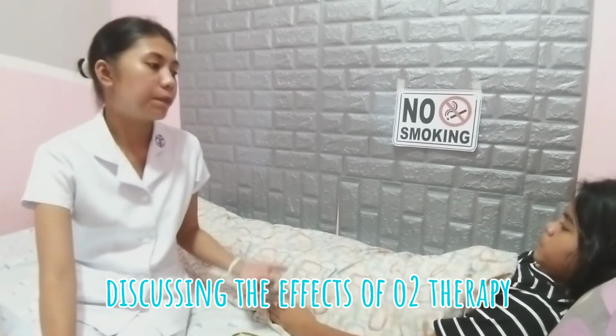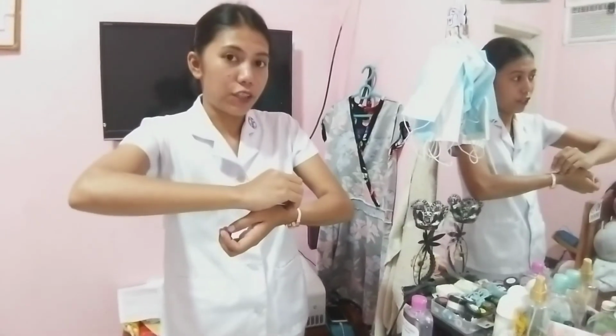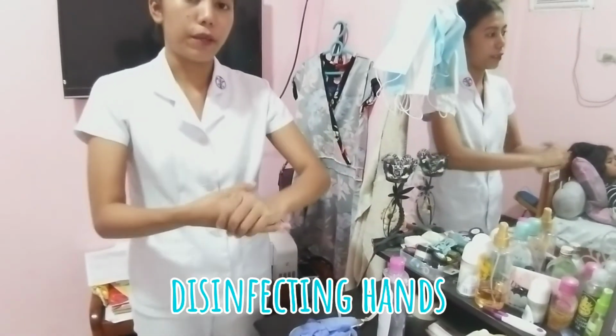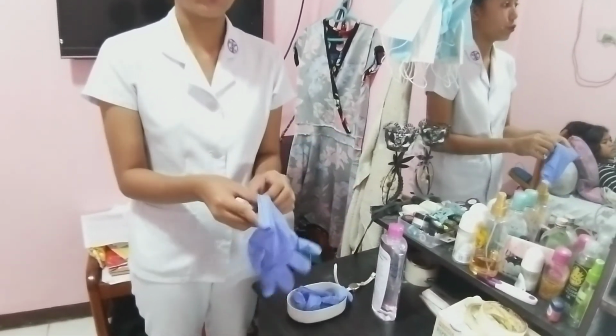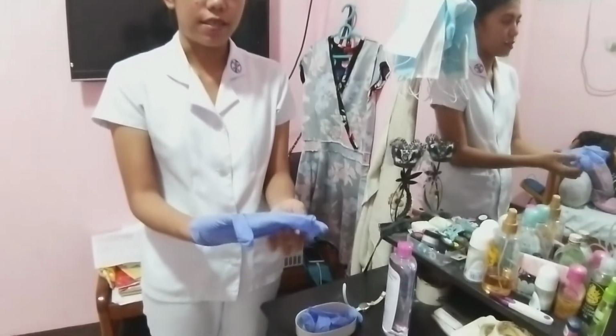So before we begin, let us first perform hand hygiene and observe other appropriate infection prevention procedures. This is to deter the spread of microorganisms. And now I am going to use the alcohol to disinfect my hands. And I also have my gloves here. This is for me to prevent or avoid harboring any microorganisms.